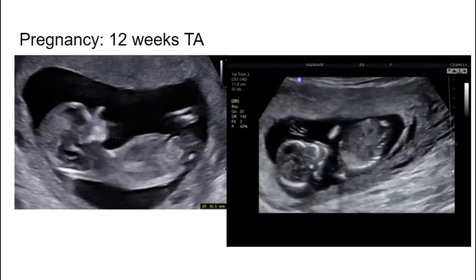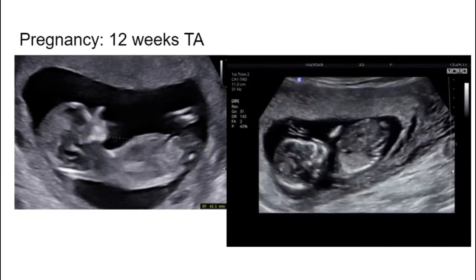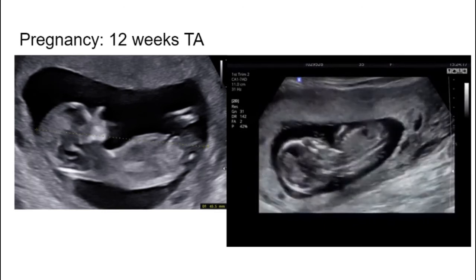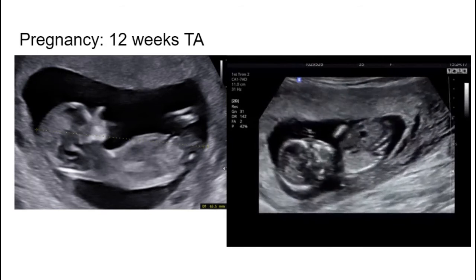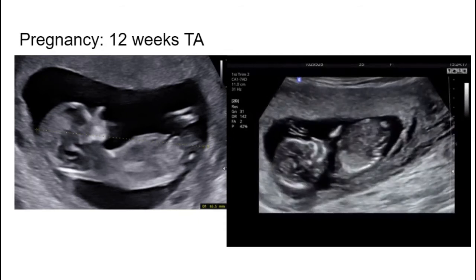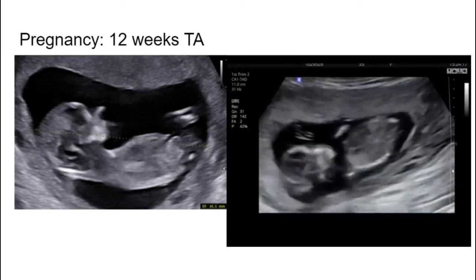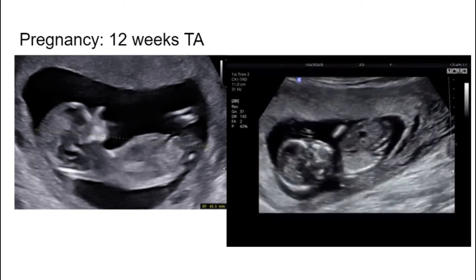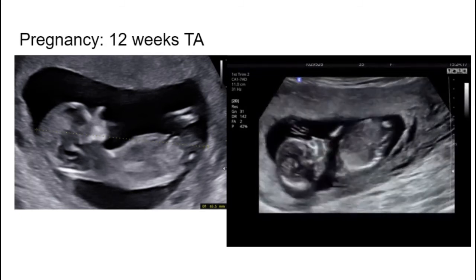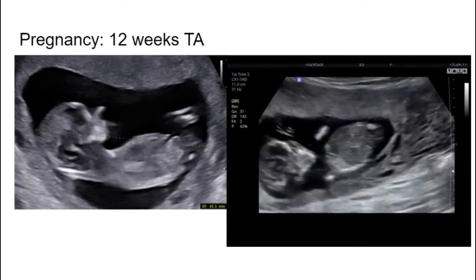And so here we have a 12-week scan. So these are the images you'll probably be more familiar with. And this is when most people would have their first pregnancy scan if they haven't had any problems with pain or bleeding. So we're measuring here a crown rump length, and you can see that's 65 millimeters, so just over 6 centimeters. And you can see that this looks much more like a recognizable fetus shape. So you can see the head, you can see the brain, you can even see little arms and legs and the umbilical cord, and then a really obvious heartbeat there in the middle at 12 weeks. And these are both transabdominal scans.